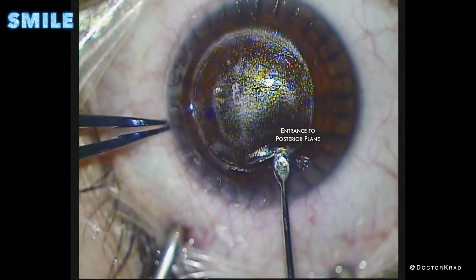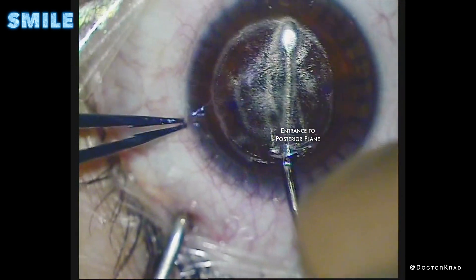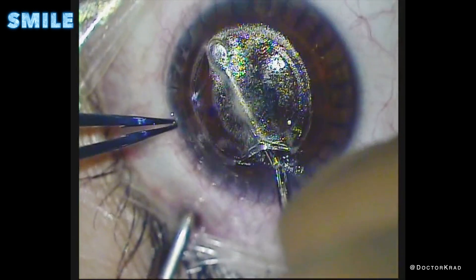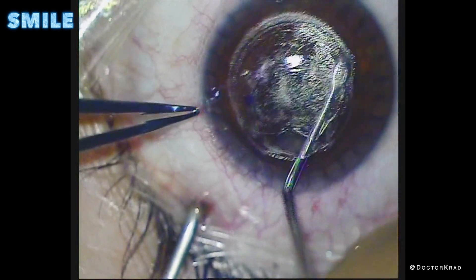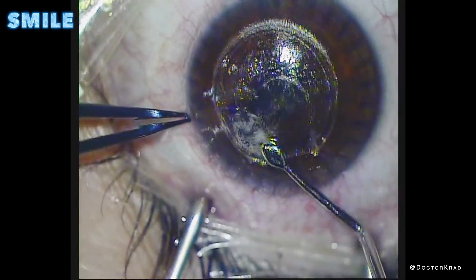Now that I've dissected that, I'm going to enter the posterior or deep plane. I go first to the right. I'm going to leave a little tag in the center on the top, and then I'm going to dissect on the left side of the deep plane. And then I'm going to break that tag and slide the disc of tissue out.